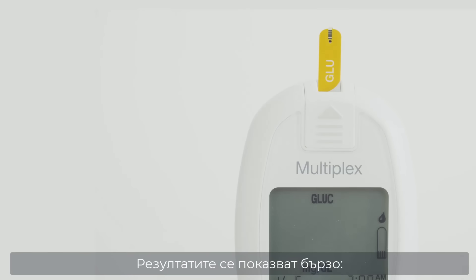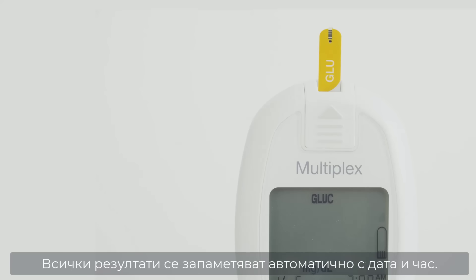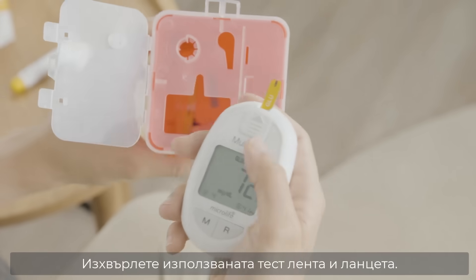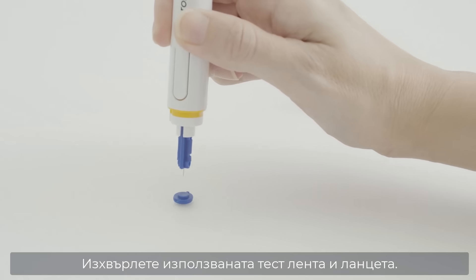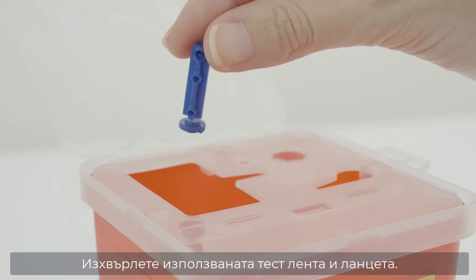The results appear in 5 seconds for glucose, 15 seconds for uric acid, and 26 seconds for cholesterol, all saved with a date and time. Eject the strip safely. The meter switches off automatically. Cover the lancet and dispose of it properly.